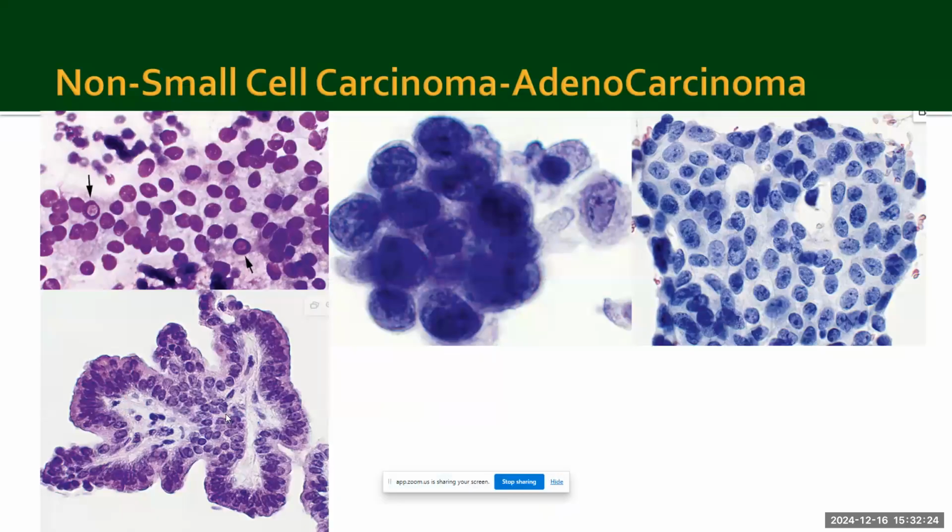So talking about non-small cell carcinoma, especially the well-differentiated non-small cell carcinoma can be challenging to diagnose in small cytology samples. Look at the image on the top left. This looks so bland, right? They are cellular. They have a moderate amount of cytoplasm. The cells look homogeneous. There is very little pleomorphism, but a subtle clue like the presence of intranuclear inclusions or clinical evidence of a ground glass appearance can suggest the possibility of a well differentiated or lepidic pattern dominant adenocarcinoma.